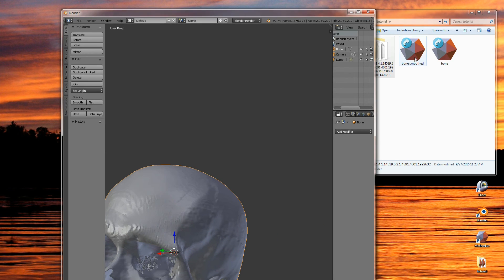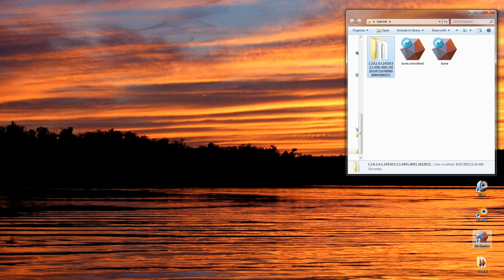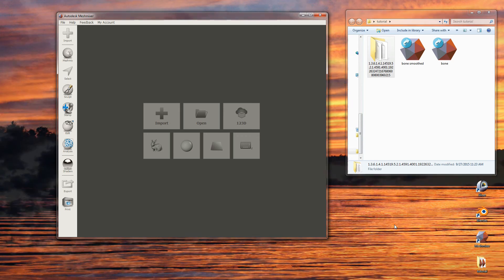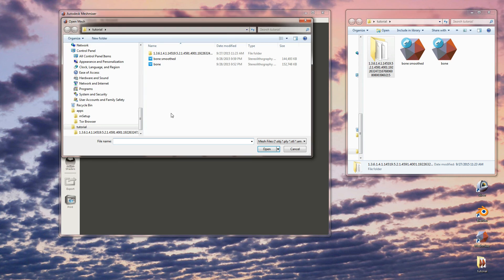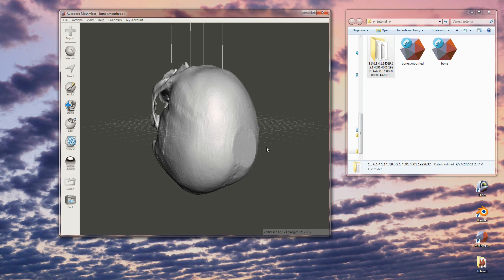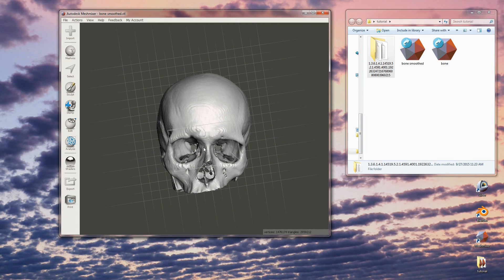There it is — it's called bone smooth. The final program to open is MeshMixer, a free software program published by Autodesk. You can download it from MeshMixer.com. Open up MeshMixer, click import, and select that bone smooth file we just created. MeshMixer is a really great software program because it allows you to do some error checking before sending something to the 3D printer. It doesn't have all of the features for smoothing and modifying the mesh that Blender has, so I prefer to do that in Blender.